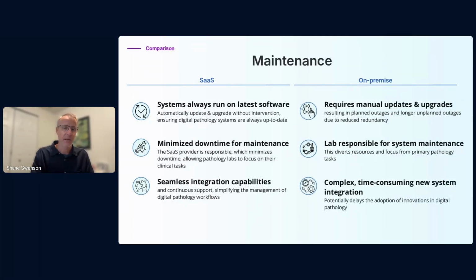So speaking of maintenance, in the case of software as a service, the vendor is responsible for this. They are making the updates on an as-needed basis. The good services that are running modern practices are making those updates daily or faster. And again, they should be totally transparent to you. There should be very rare required downtime for maintenance, because these software architectures are designed to be fault tolerant and resilient and what's called elastic, meaning they can scale with need. And so doing an installation just means adding new servers and then taking down the old ones transparently.